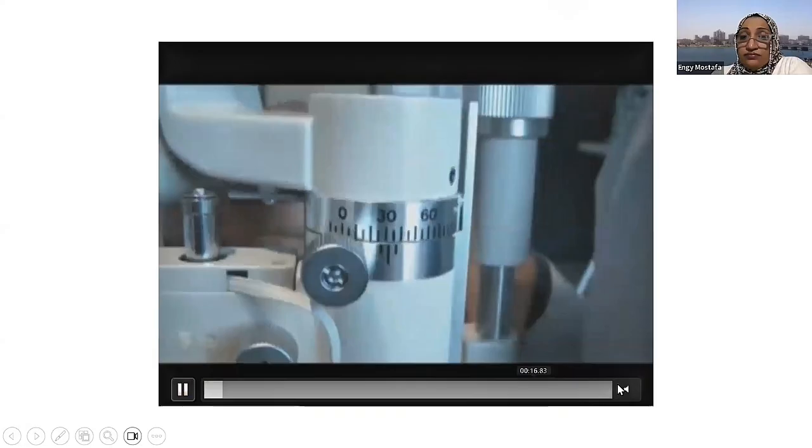So, are you confused yet or not? Let's have a quiz. So, what do you think this is? Which method of illumination is used in this one? Here we can see this is a dislocated, misplaced posterior chamber IOL, and we can see the reflex. So it's more like a retroillumination. Okay, we are looking at the retroillumination of the fundus.